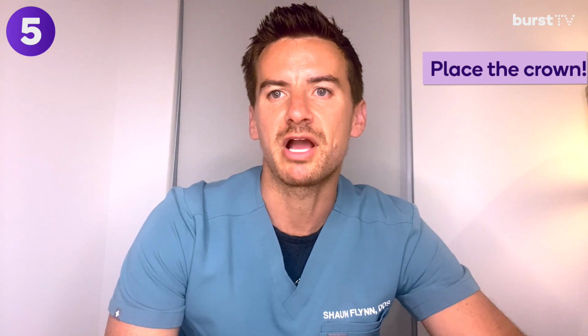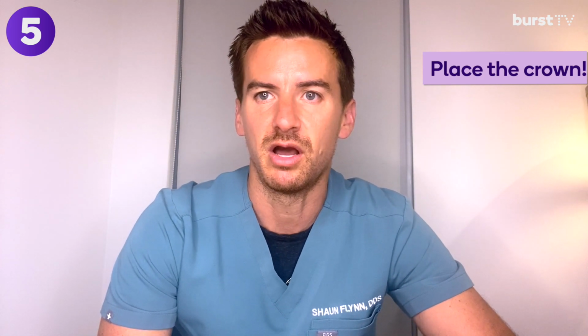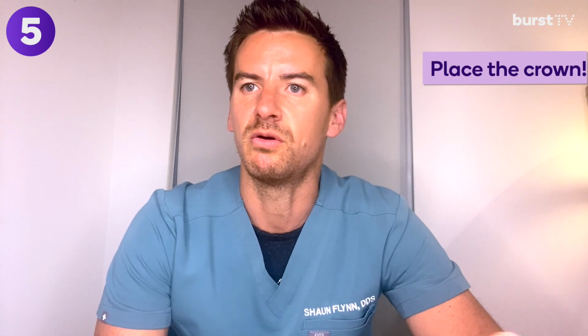The screw retained will actually show the access hole slightly, even if you fill the hole with the filling material. But they give you the best option to access the implant if ever the implant actually has to be retightened because it becomes loose, for example. Now, the cement retained has no access hole, so it's going to be much more cosmetic crown. You won't be able to see any kind of dark hole area, but if for some reason something does happen to the implant where it needs to be tightened, then you actually have to go ahead and destroy the crown to get access to the implant.